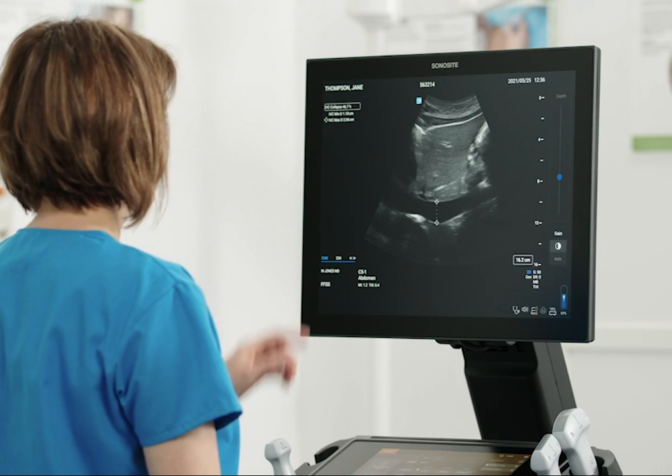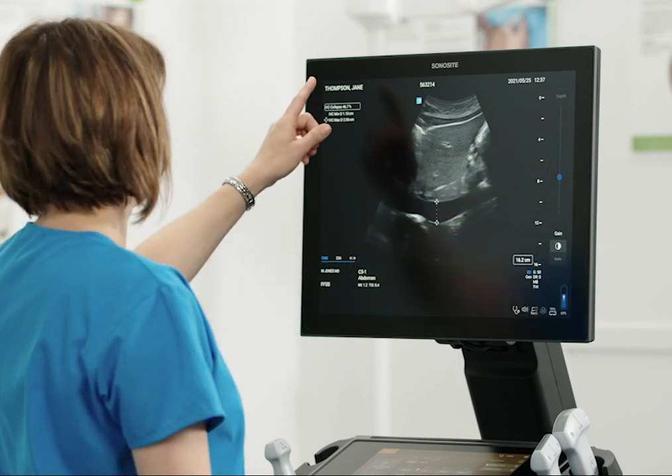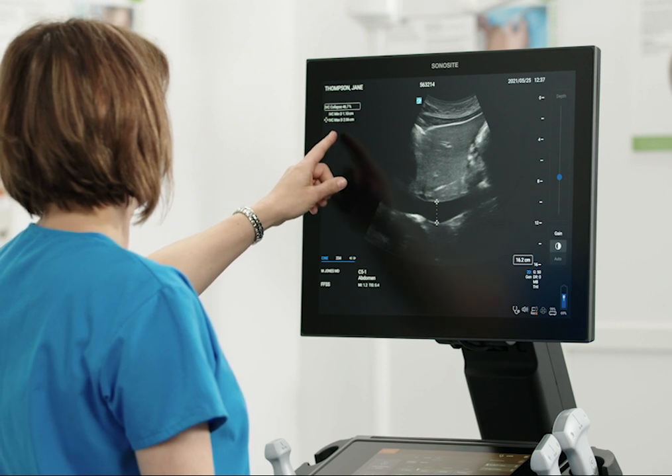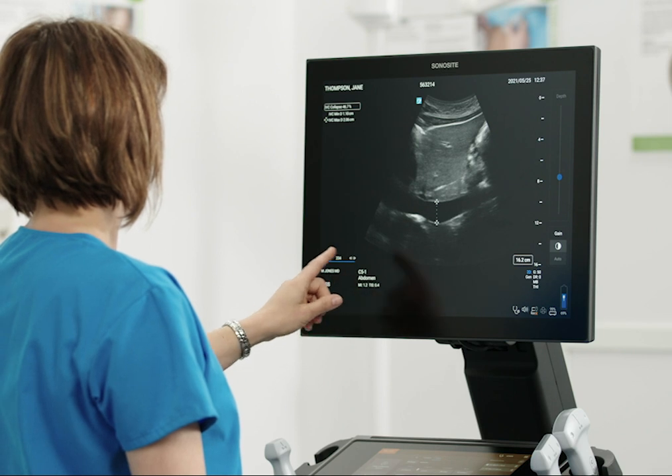The clinical monitor also displays your image and depth markers, calculations and measurements, patient and clinician information, as well as study details and system status icons.